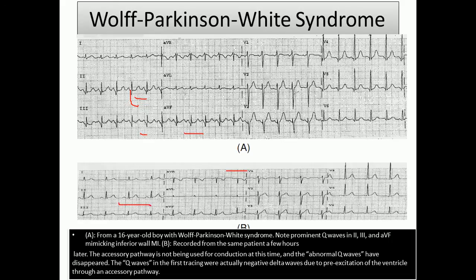it will show there wasn't any Q wave in these mentioned leads, and it is just due to negative delta wave.